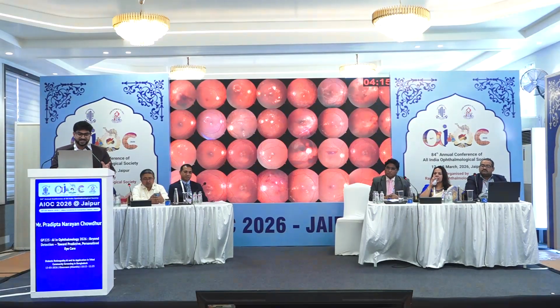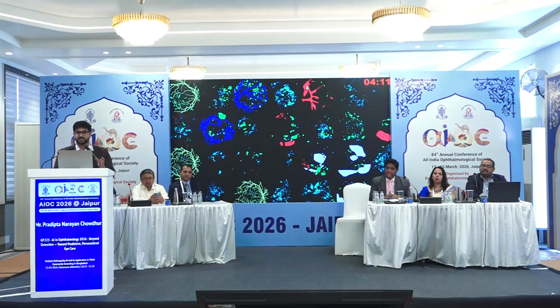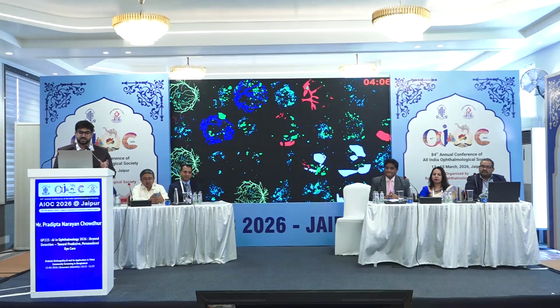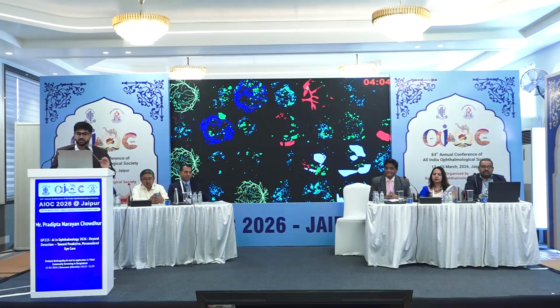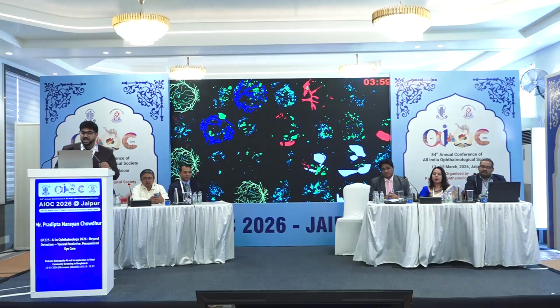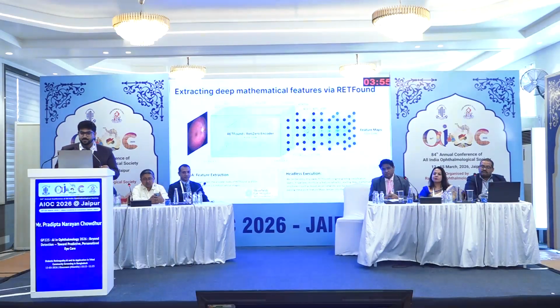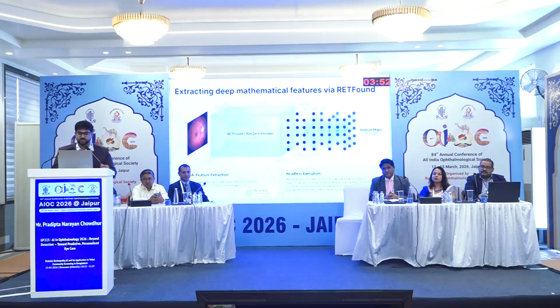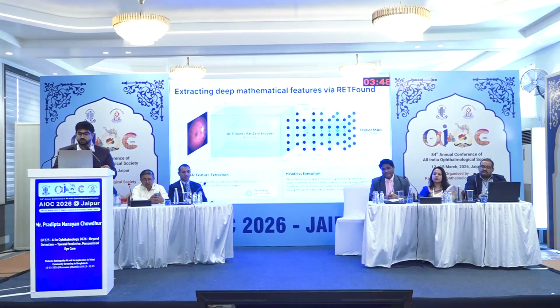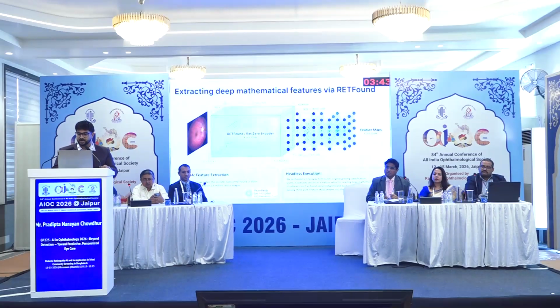This is a very cool dataset of images that we have. But what's even cooler is when we extracted all the features out, this was one of the biggest annotated datasets in our hospital. As you can see, all the most minute exudates, hemorrhages, and new vessels were extracted out. This was done with the help of clinicians throughout the journey. And as I mentioned about the RETFound model, it was built at Moorfields in the UK with 1.6 million retinal fundus images. We used it and fine-tuned it for our AI.